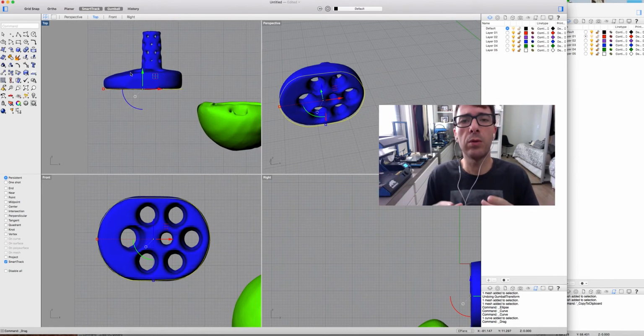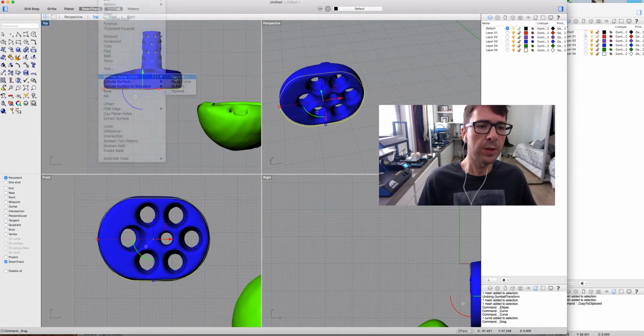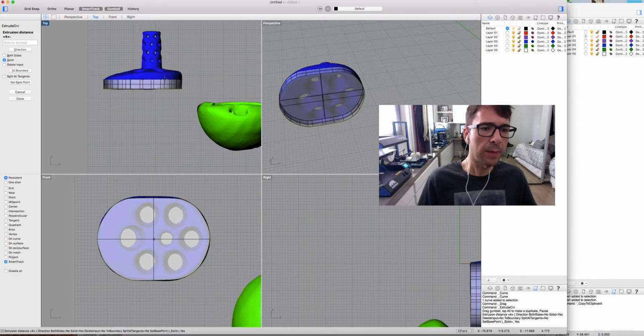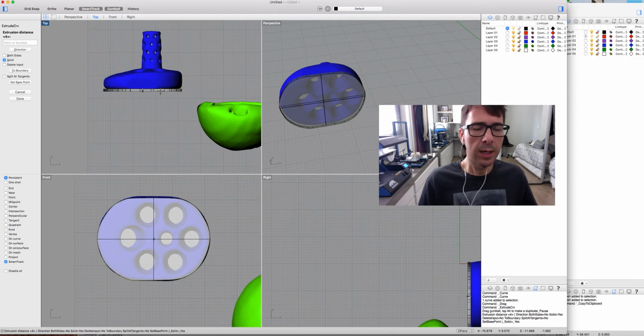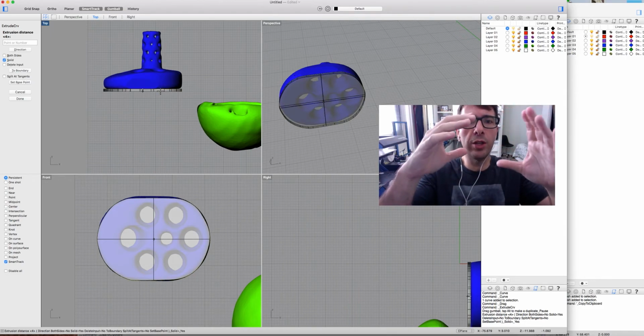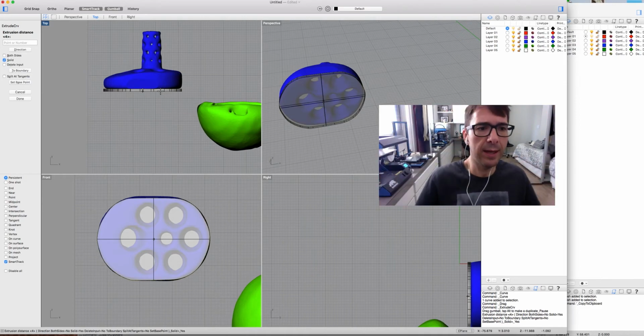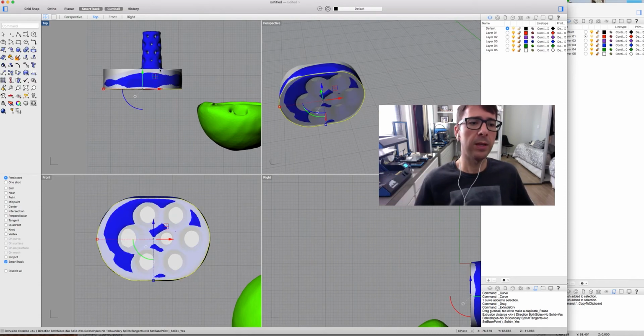We are going to turn the 2D dimension into 3D. So we can go to solid, extrude, planar curve, straight, and just click here. So we can see, we can extrude the way we want. It's not in one direction only. So we're going to extrude to the higher part of the implant. That should be just right here.